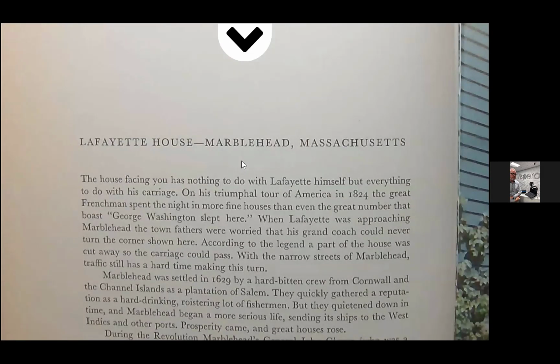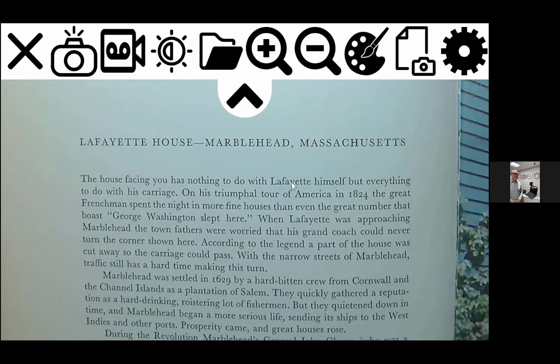And quickly it pops up that software. You'll notice on the screen here, you've got text. I've got a textbook underneath my camera. One of the other things you might notice is this large arrow at the top. If I click on that, this is the default software. I like to customize mine a little bit, but by default, this is what you're going to see when you install the software. And the menu, or all the tools, are up on the top of the screen.